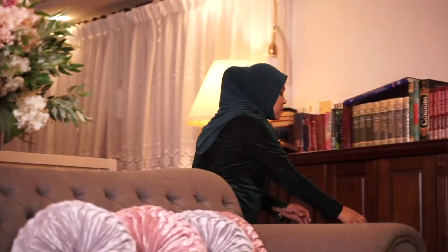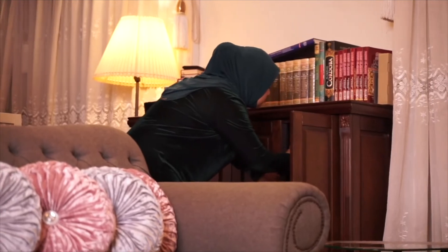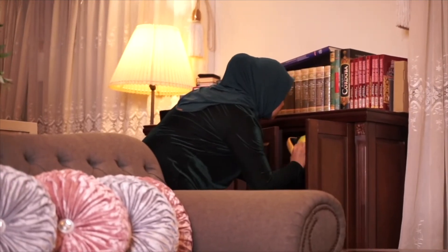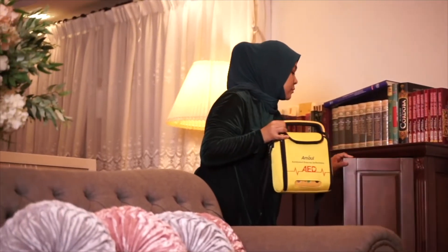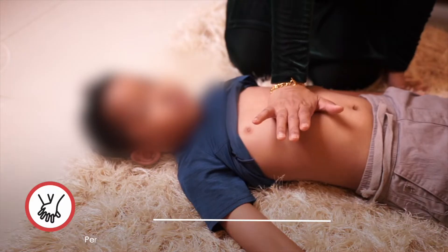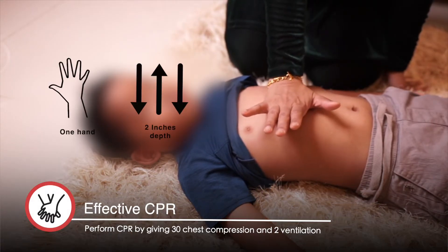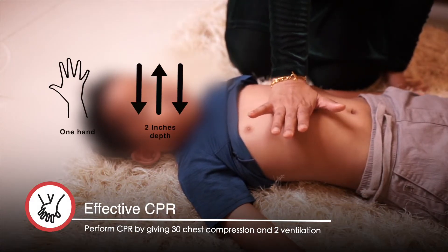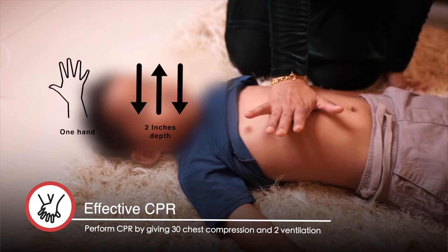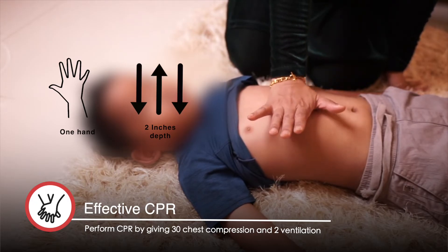Call the emergency services, and only if there is one nearby, go and fetch an AED. In the absence of an AED, or whilst waiting for someone to arrive with one, begin cardiopulmonary resuscitation.